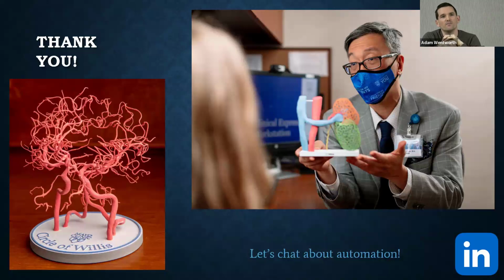Yeah, in fact, we've run on some extraordinary cases, and I will say that some of that AI segmentation really depends on what kind of data you're training it on, and you may split that into two separate kinds of weightings. If you run a script of segmentation and it does not perform well on that spine, maybe it's an extreme case, we do use an alternate script that is more designed for stuff that's outside that box and that can handle that more abnormal anatomy. But for that one, it does not separate each vertebral body separately. Instead, it will segment bone and things that are not bone as a simplification. Great. Thank you for that.